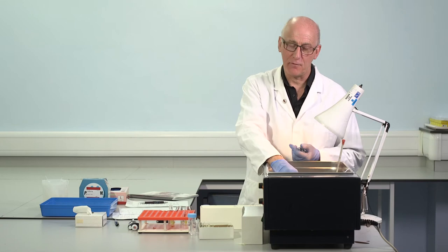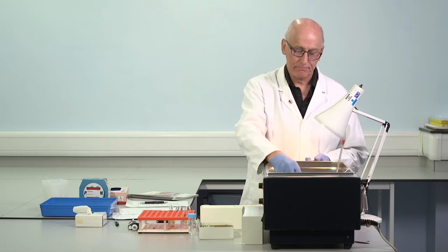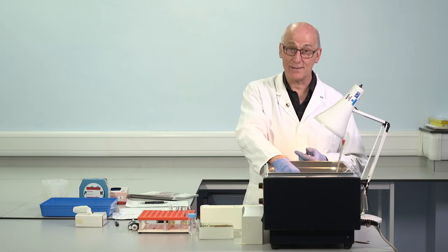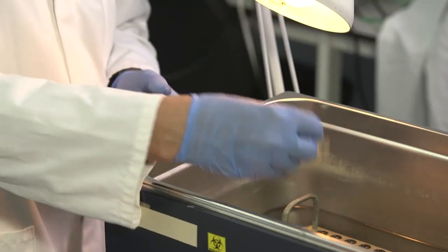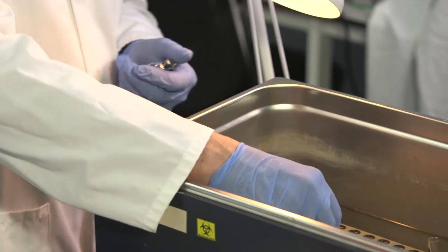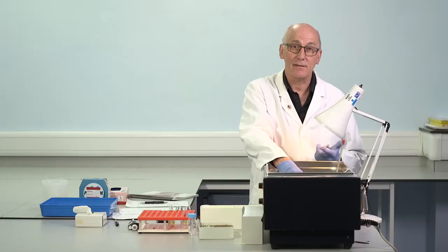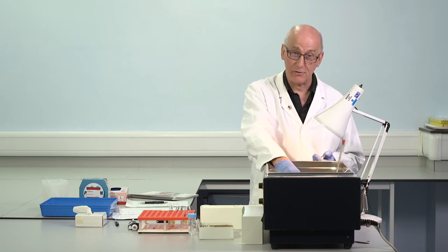So we can make use of that information. Where we've got an abnormality, a prolonged APTT, if we add normal plasma and the defect is corrected, the clotting time is corrected, back or very close to the normal range, most likely we've added the missing clotting factor. And this makes us think in particular, of course, about clotting factor deficiency. At this point, we don't know, is it 8, is it 9, is it something else? And we need to go on and do further tests to characterize that.